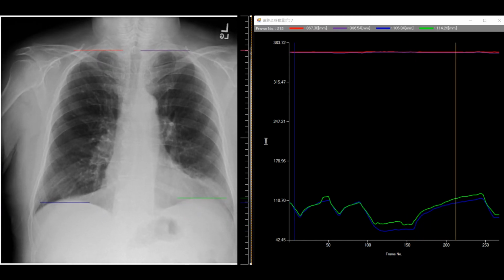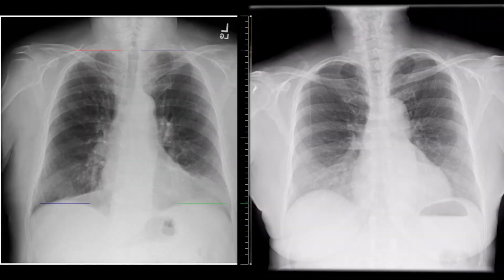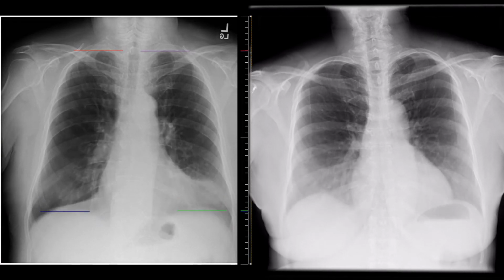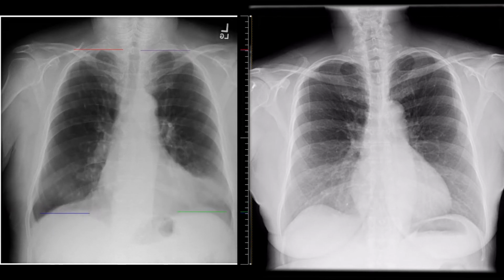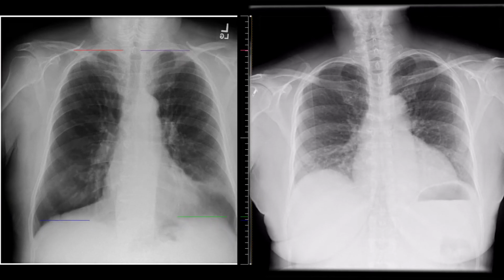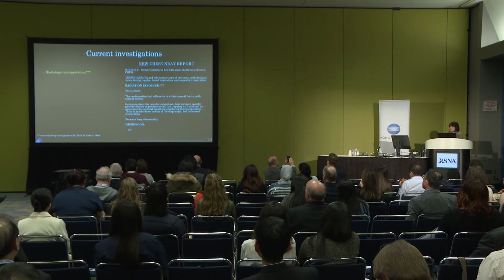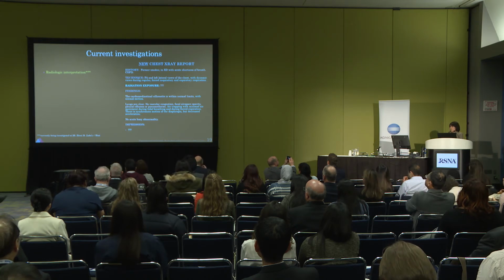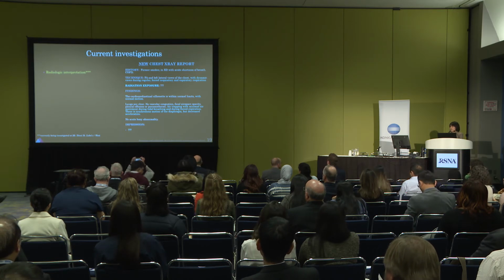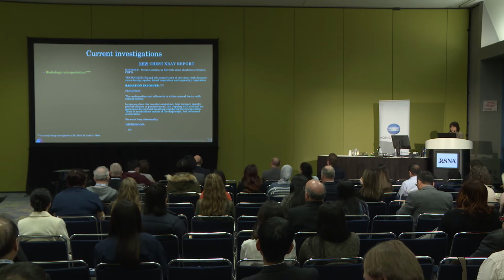And also just to compare to a normal patient breathing. Right, now that you've seen someone breathing, it's almost like seeing a normal person huffing and puffing after a marathon. That person breathing is very obviously not at baseline with their normal breathing cycle. So this person you can see as a normal patient breathing normally, and then on the left you can see that really constricted movement of those lungs. So one of those current investigations at Sinai is in how to interpret those dynamic digital radiographs. There really isn't a good standard way of interpreting what we're seeing. There's so much more information on that DDR exam.